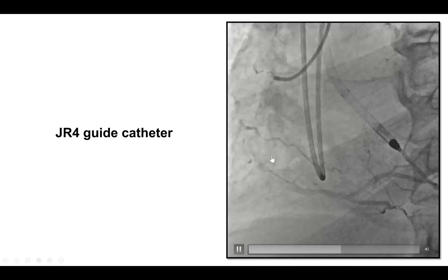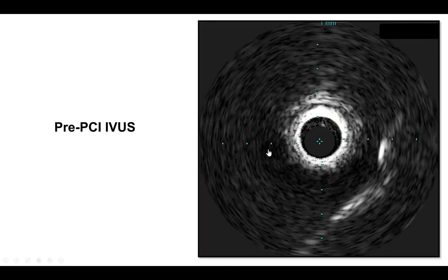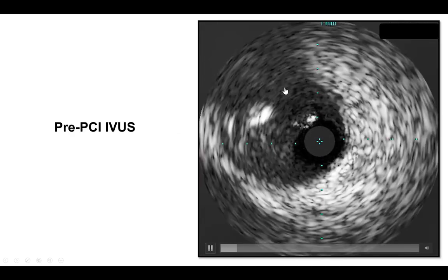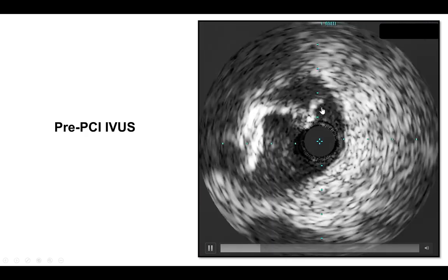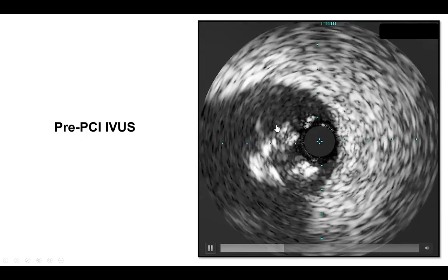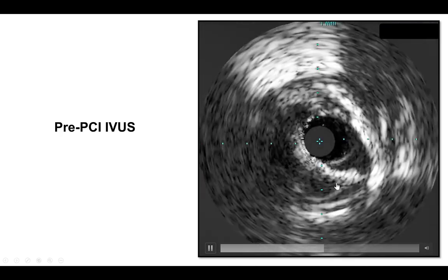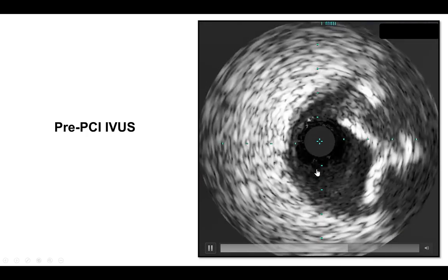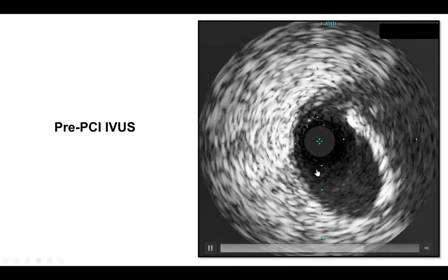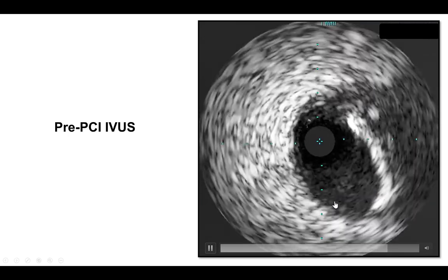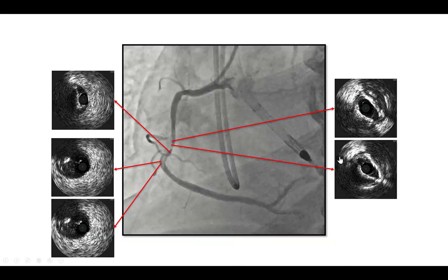We engaged the right coronary artery with a JR4 guide. There is still the intraluminal filling defect, although it has been a few days since the diagnostic angiogram. We performed intravascular ultrasound that demonstrated the presence of calcification — severe calcification distally, a filling defect, and again severe calcification. The reference vessel diameter more proximally was 4 millimeters, a large proximal diameter. There is significant calcification a little higher up from the area of the filling defect, which appears to be soft, likely representing thrombus.